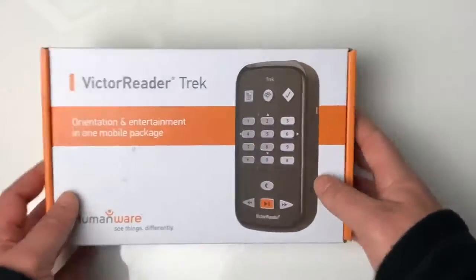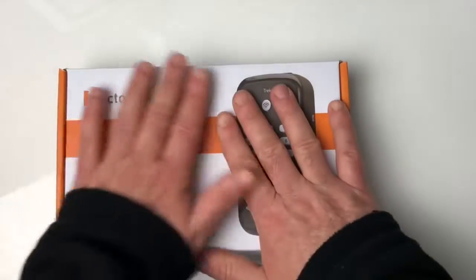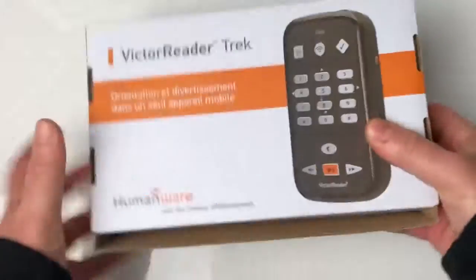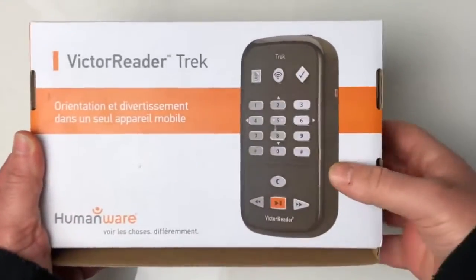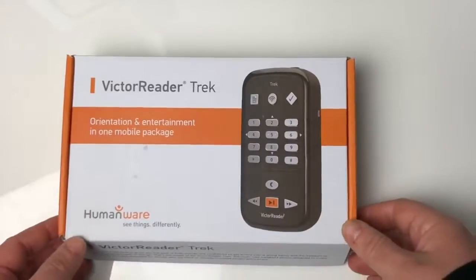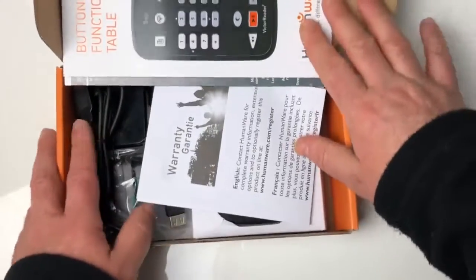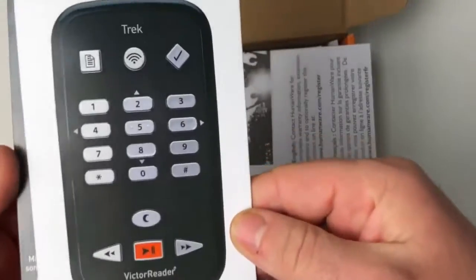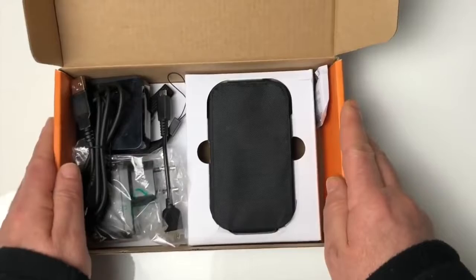Voilà, comme d'habitude, la boîte est sur le bureau. On a une boîte rectangulaire avec le nom marqué en haut à gauche et une photo de l'appareil sur le dessus. C'est une boîte classique — dessous on retrouve la même situation avec l'appareil à droite et le nom de l'appareil. On va maintenant ouvrir la boîte pour le déballage. Lorsqu'on lève le couvercle, on tombe tout de suite sur un dépliant expliquant ce qu'est le Victor Reader Trek, et directement sur les éléments de la boîte.